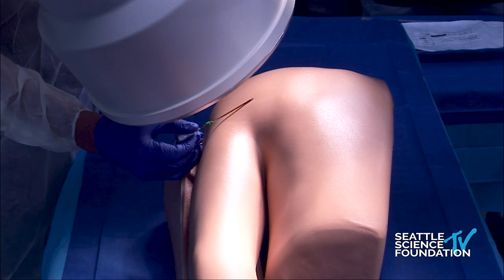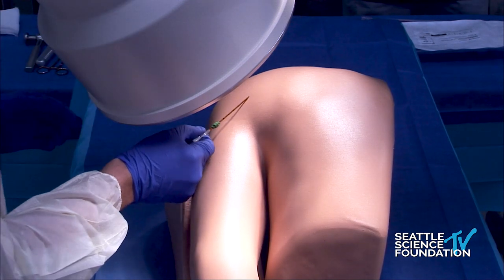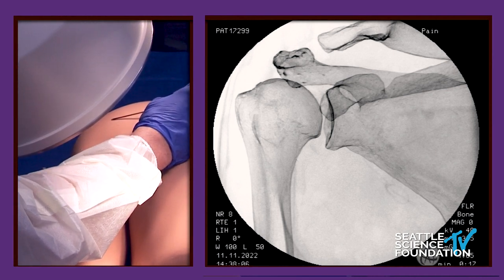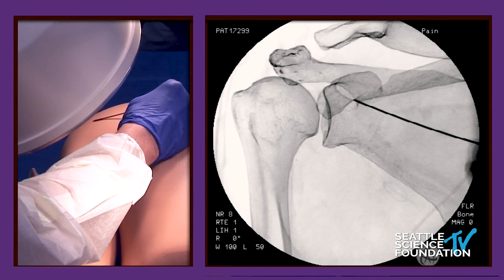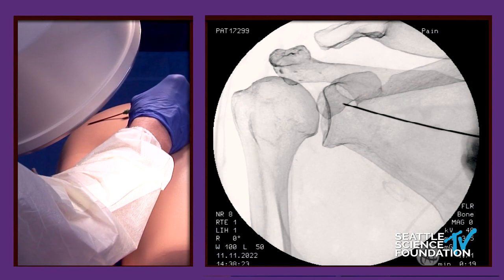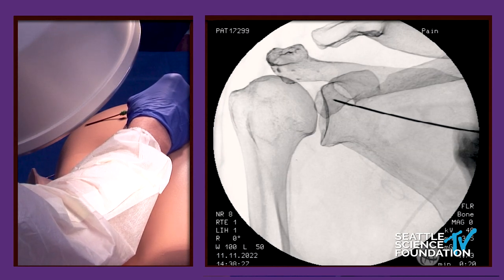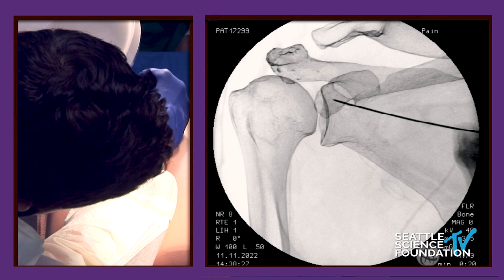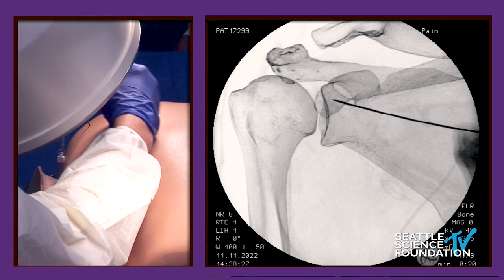Let me get a picture here. And Steve, can we collimate here? We'll save Gavin's beautiful fingers. When he's 83, he'll remember this day and thank me for preventing his horrible arthritis. So that's a little bit more lateral to that, closer to the glenoid fossa. He's getting there. So the unique thing about cooled radiofrequency ablation is that you create a nearly one centimeter diameter lesion. So you don't want to be right on the edge of the glenoid. You basically want to be just a touch medial to that, but otherwise that looks perfect.